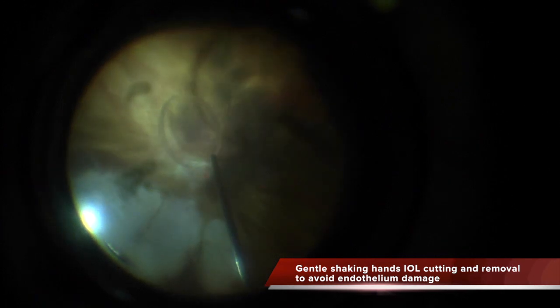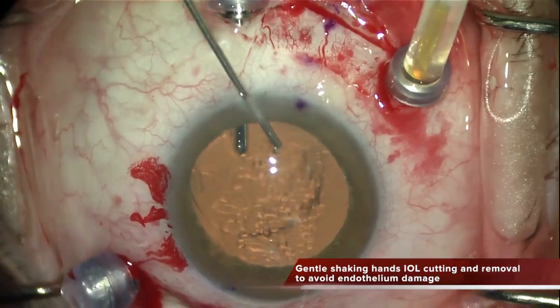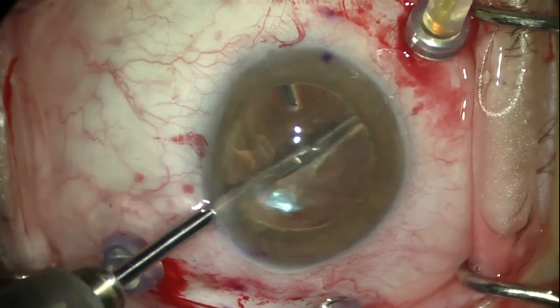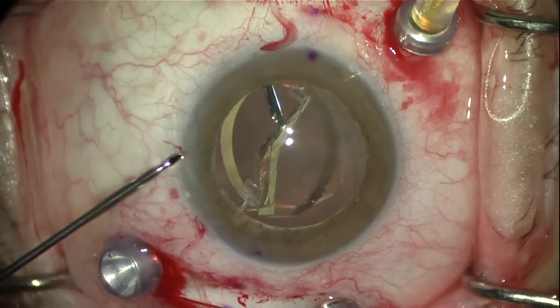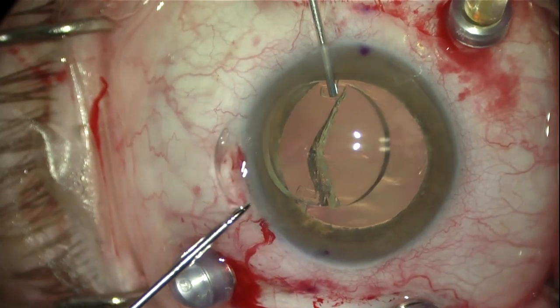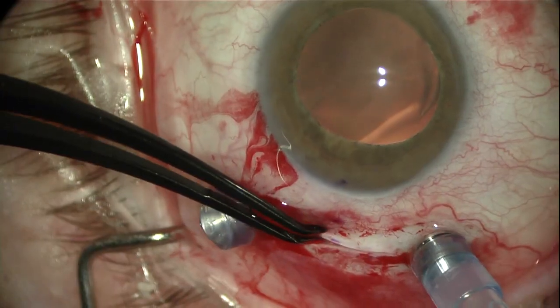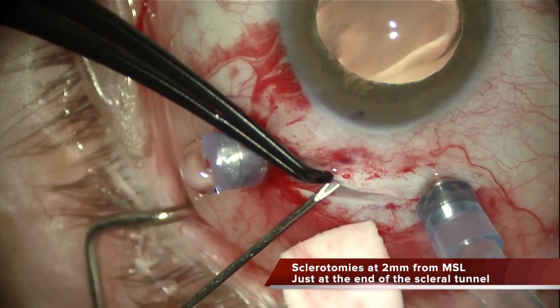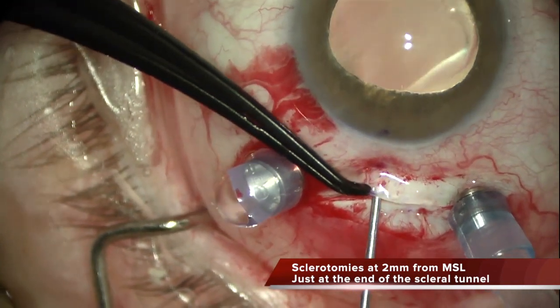Then I perform the complete vitrectomy and prepare the paracentesis and the main 2 and 2.8mm incision. I lift the IOL with suction, make a very good grasping in the middle of the IOL with an ILM forceps, and then inject more viscoat into the anterior chamber to protect the endothelium. Then I cut the IOL with MST IOL scissors and remove it. It is quite important to protect the endothelium during turning of the IOL with a cannula to avoid any endothelial trauma. Then we slide the 25G needle until we reach the end of the tunnel, which is going to be 2mm from the limbus.